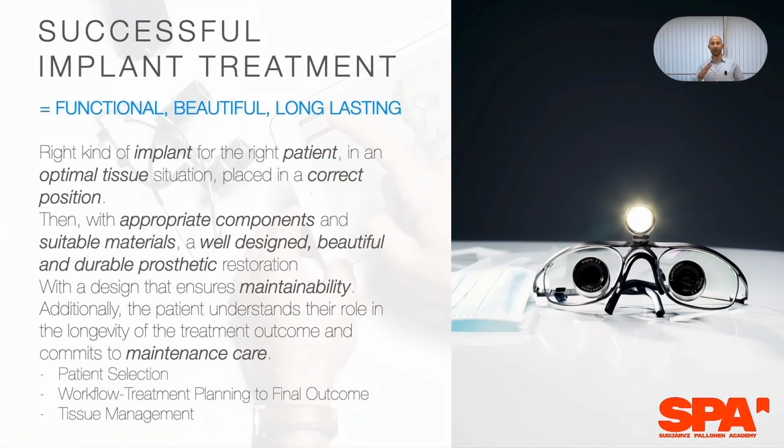So here we go. Implantology, not that hard, right? You'll only have to select the right kind of implant for the right kind of patient to an optimal tissue situation and place the implant in a correct position. Then you'll have to use appropriate components and suitable materials for a well-designed, beautiful and durable prosthetic restoration, have a design that will be maintainable by the patient, and have the patient know the patient's role in keeping the implant and the restoration intact for a multitude of years. So that's easy, right?